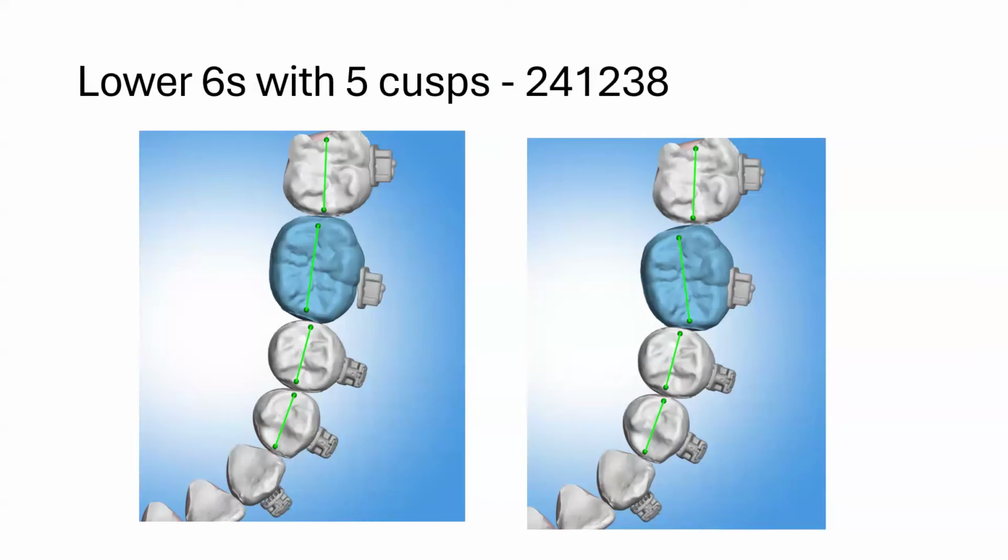Very good. For anterior teeth, I'm going back to what my treatment goals are. If I have someone that's a bit bimax and I'm really trying to upright incisors, there's a good chance I'm going to, there are a lot of options out there. Some systems market variable torque brackets where you're stocking 3 or 4 different torque prescriptions. There's always the flipping of a bracket; with the Pitts system, you're changing your torque by 24 degrees when you flip a bracket. Rather than any of those options, I choose to wedge the base. If somebody has flared incisors, I'm going to put a 15 to 20 degree wedge in the base to upright those incisors. That is mainly driven by what the predictive outcome looks like and what I want the predictive outcome to be.